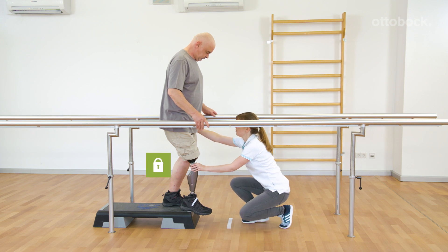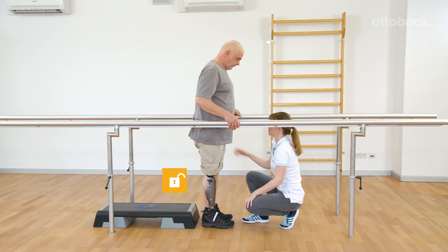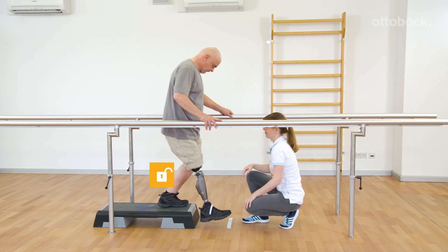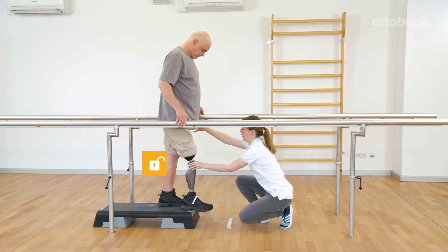Stance function is deactivated as soon as the knee joint rotates forward. This movement pattern has to be practiced to avoid insecurity and to build trust in the prosthesis.